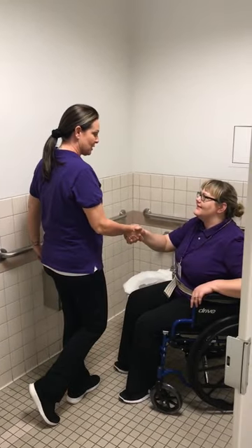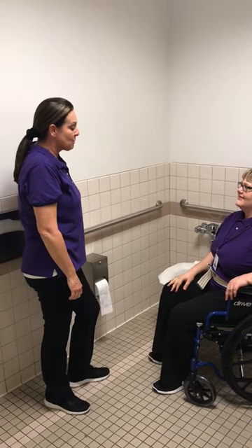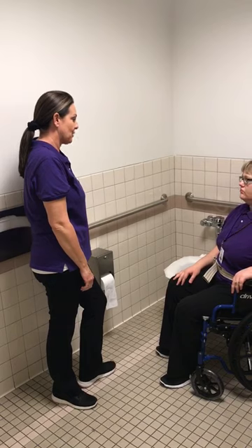Hi Sasha, my name is Loma. I'm an Occupational Therapy Assistant student. How are you? Good, how are you? I'm doing good, thank you. I'm going to teach you today how to transfer from the wheelchair onto the toilet. Sound good? Sounds good.